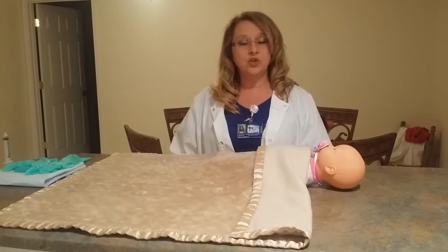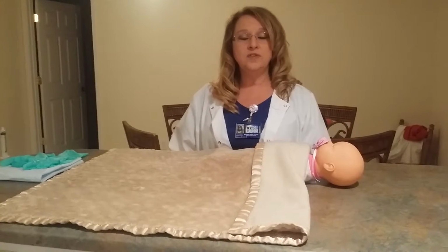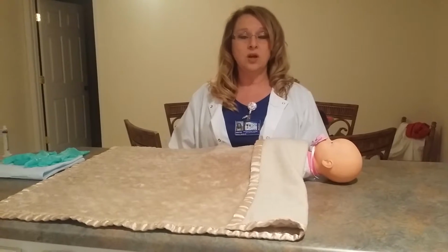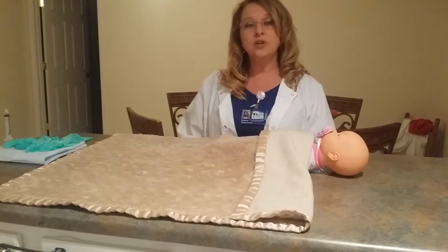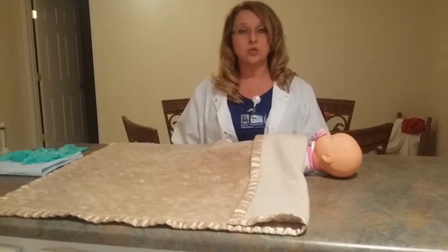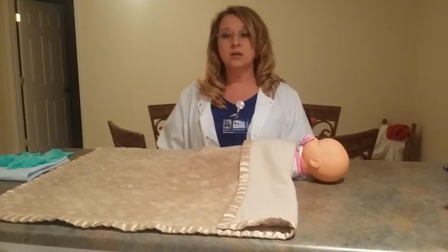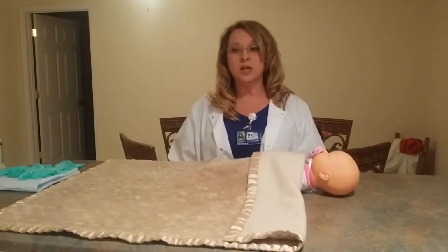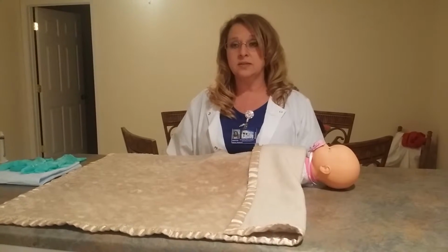The need for the catheter should be reviewed daily by the nurse and the physician and removed as soon as need for its use can no longer be clinically indicated. This will help to prevent catheter-associated urinary tract infections, or CAUTI as they are known. CAUTI is a hospital-acquired condition with payment implications because it can be reasonably prevented using best practices.